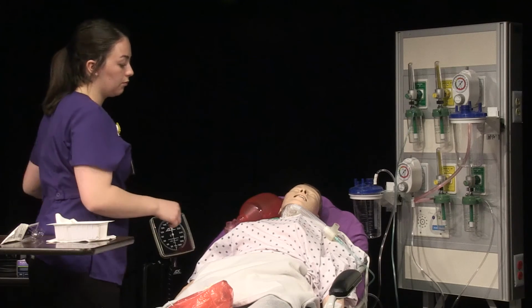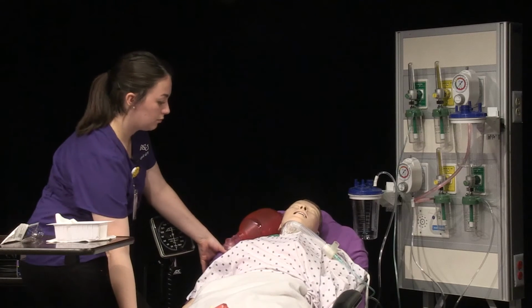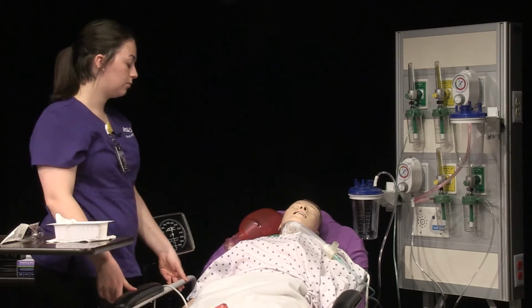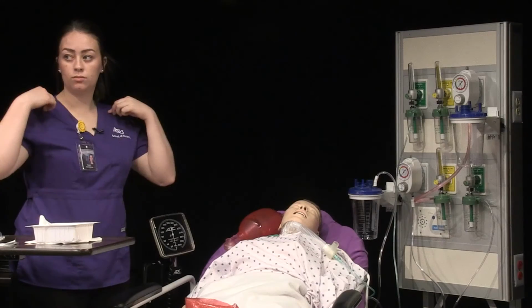Okay. Return the bed to its lowest position. Raise the side rails. And verify that the call line is within reach. Don clean gloves.